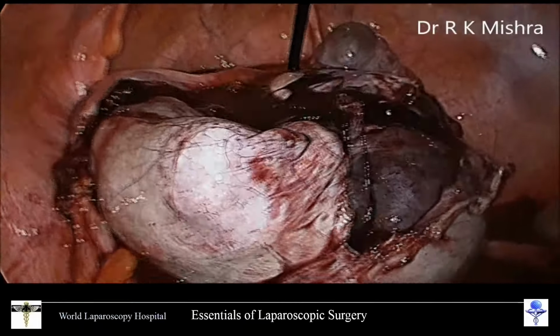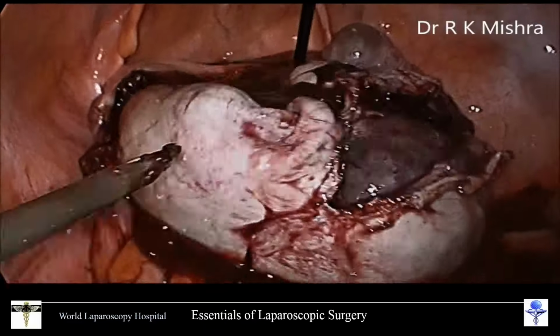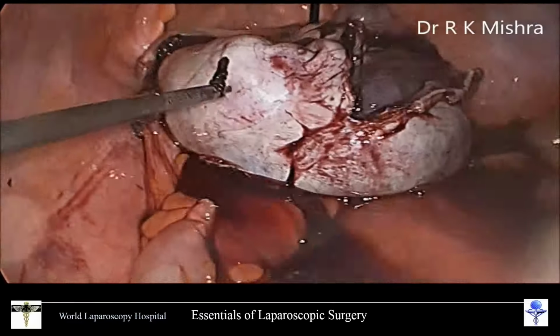So, slowly it is going out, and a lot of fluid is actually draining vaginally.